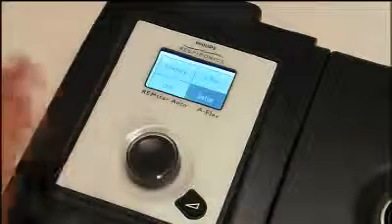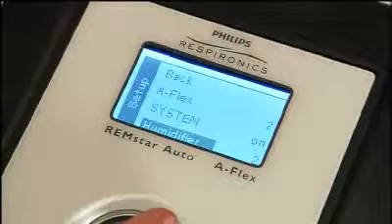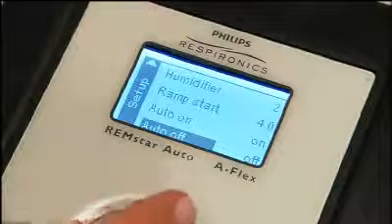Let's look at some options available under Setup from the home screen. Turn the wheel to highlight Setup and press. The Setup screen shows four lines at a time — use the wheel to toggle through the options. The choices may vary according to your device and which features have been enabled. Ramp Start allows you to increase or decrease the starting ramp pressure on your device. System 1 Resistance Control lets you optimize the comfort of your Flex setting based upon the mask that you're using. Ask your home care provider for more information.